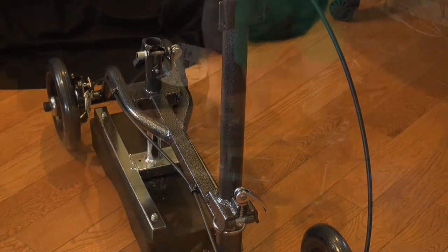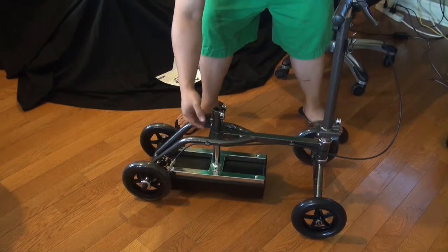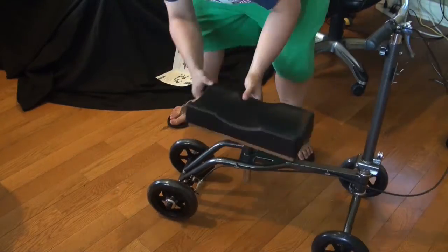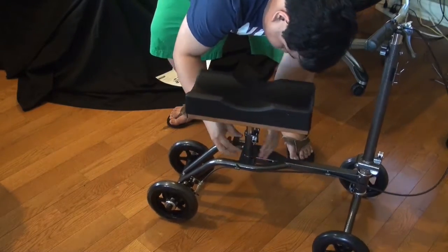Next, we're going to need to let go of the seat by unscrewing it first. Then you pull it back and you can adjust it to the height that you desire, and just screw it back.